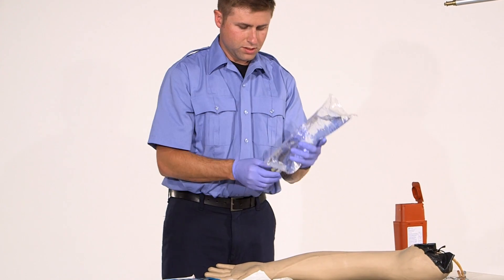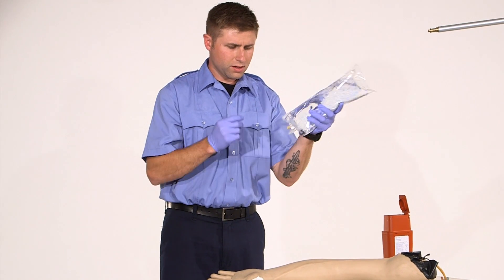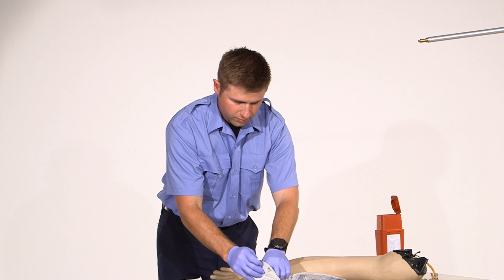At this time, I'm going to take my bag, pull that, and I'm going to spike the bag.